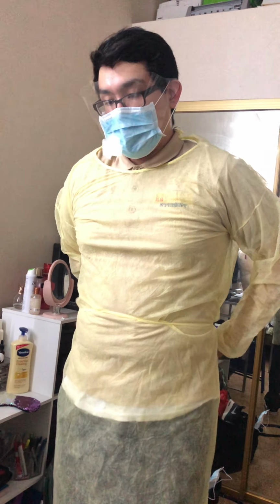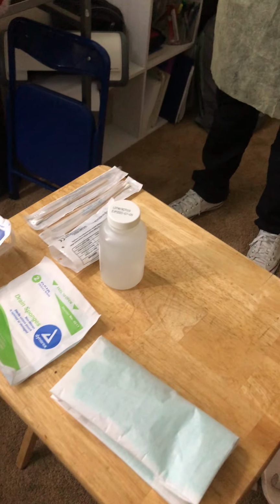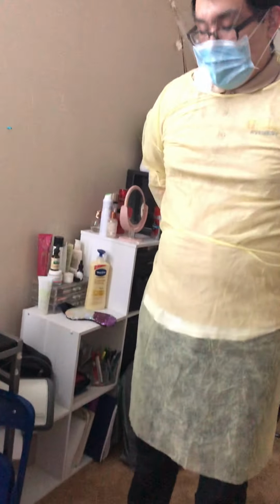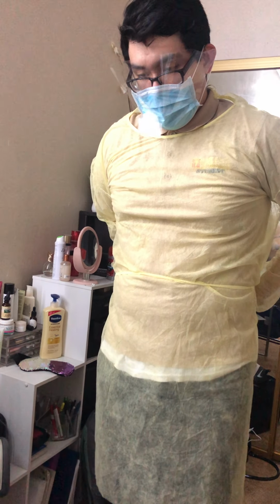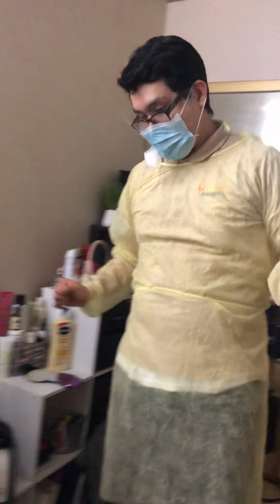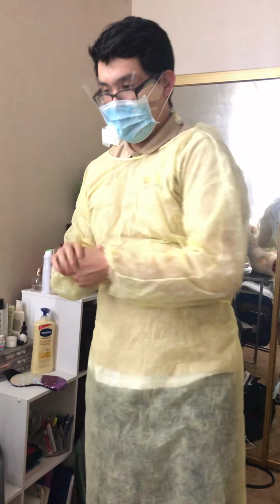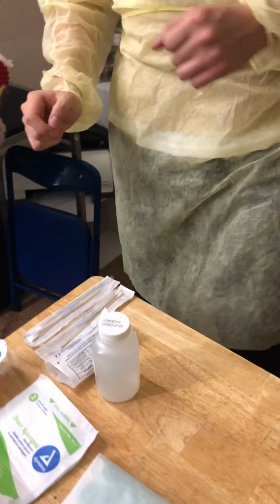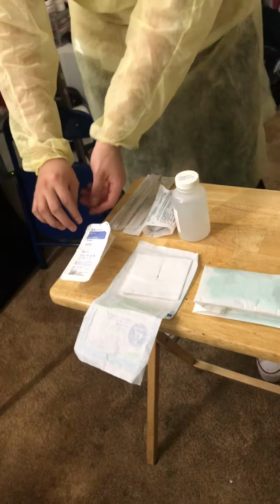At this moment, I want to again sanitize my working station and raise it to my waist level. Everything's in working position. That way I don't break sterile field. There we go. I'm going to go ahead and hand hygiene one more time. Prep my sterile field. Right now I can cross it because nothing's open. Once everything's open, I should worry about not crossing.